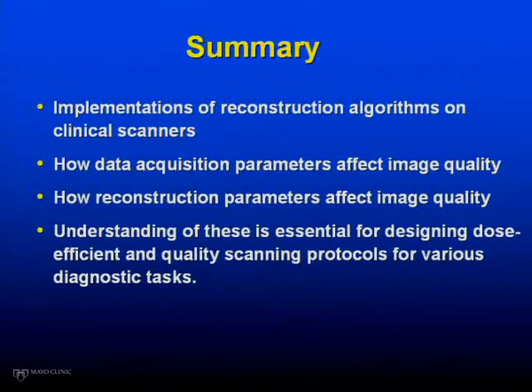Other than that, I don't have further information to answer your question. Noise and contrast are quantifiable, but for the slight loss of spatial resolution, I'm not quite sure. If the effect is very small, then when you reconstruct with a soft tissue kernel or thicker slice thickness, that slight degradation of the spatial resolution may not be a big effect. That's my guess.